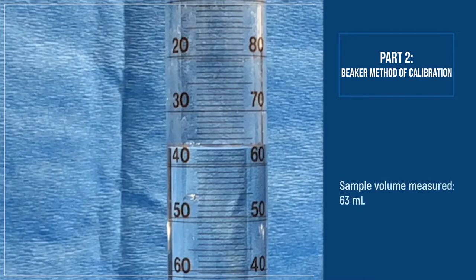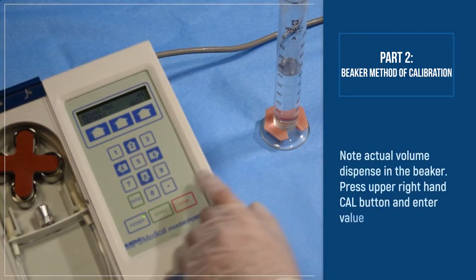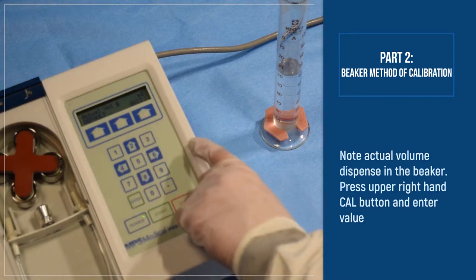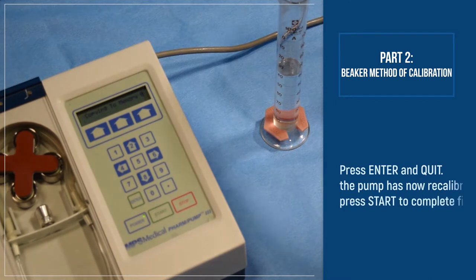Note the actual volume dispensed. Press the upper right hand Cal button. Resume the fill by pressing the start button.